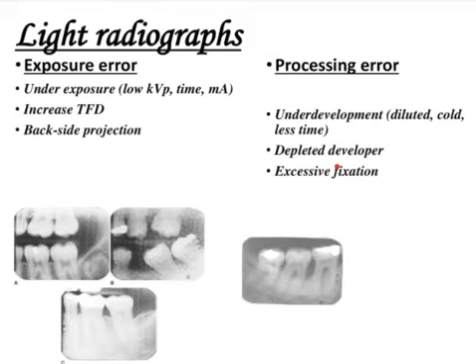That means the target is inside the X-ray tube head. If you remember, a dental X-ray tube has a tungsten target. So sometimes in the textbook you will find target to film distance or focal spot to film distance, TFD or FFD. So D is for distance and the F in between is always the film.